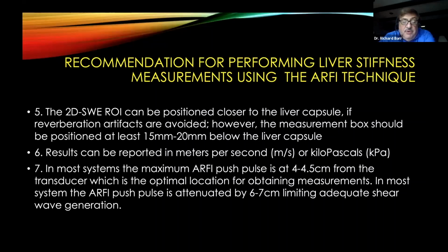We can report the results either in meters per second or kilopascals. I think of this as either centimeters versus inches. So it's really very easy to convert one to the other. And actually the Philips system will give you both in the final report.